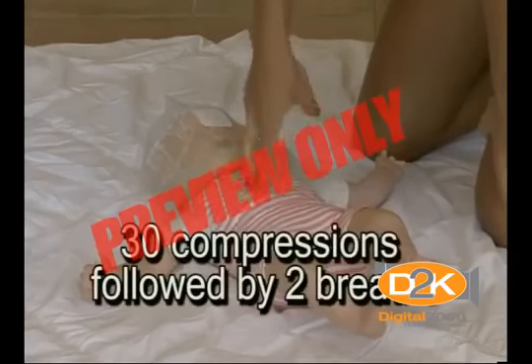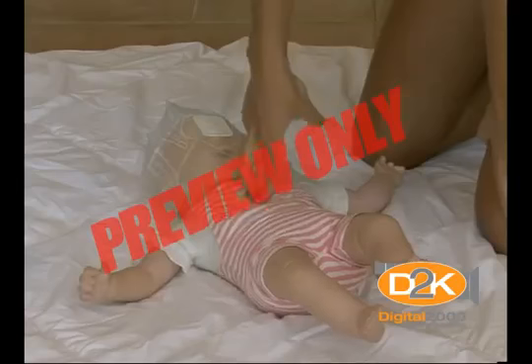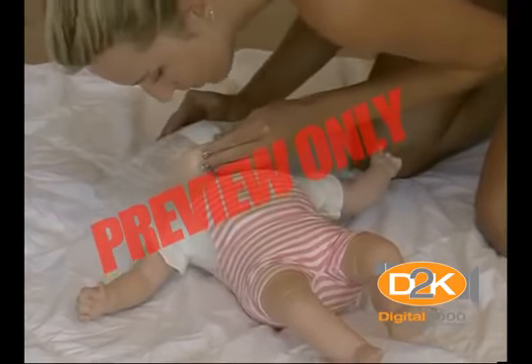Continue to perform 30 compressions followed by 2 breaths until EMS arrives, an AED arrives, or the infant shows signs of life. Once an AED arrives, immediately place it into operation.